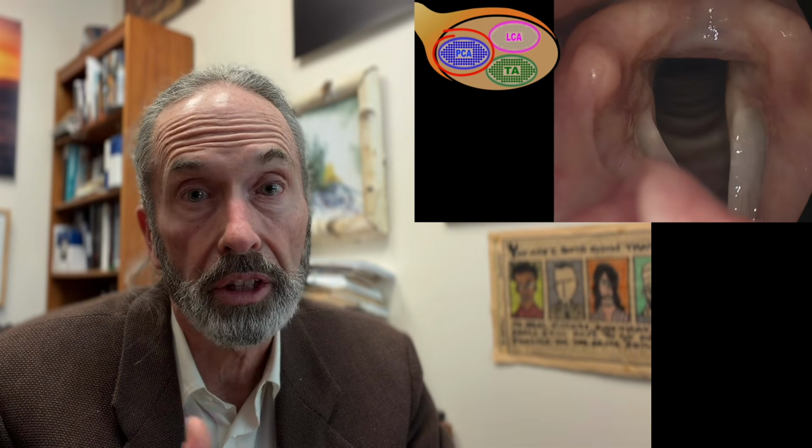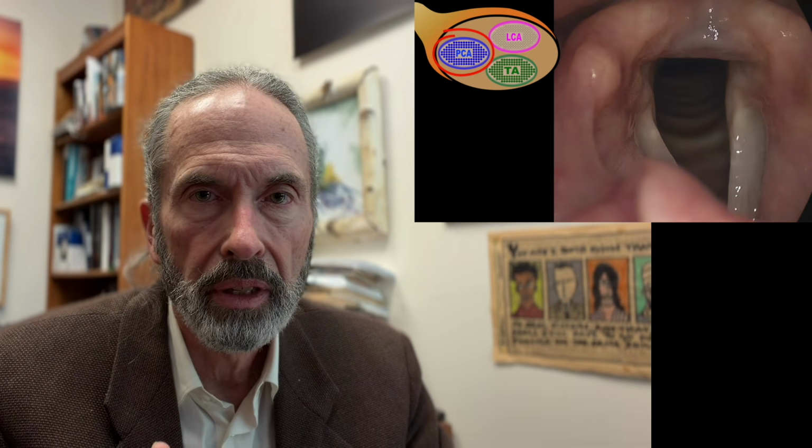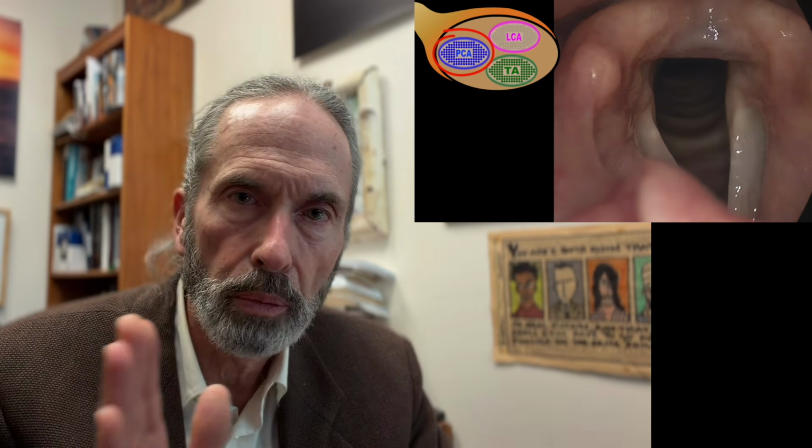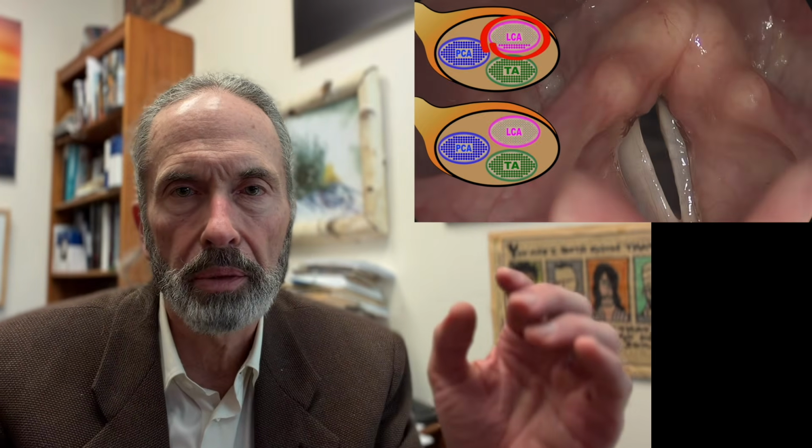All right, we watched the inspiratory task 3 times. I would say pretty clearly the right vocal process is opening all the way. Now during phonation, the right vocal process comes in, although it comes in pretty incompletely. I think there's 2 possibilities here.